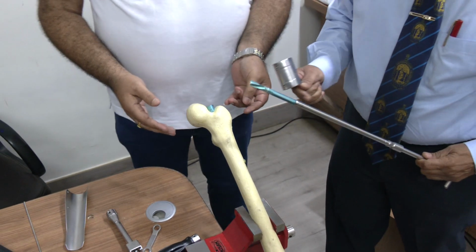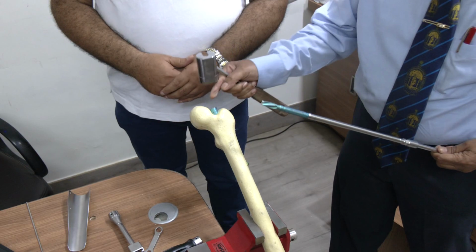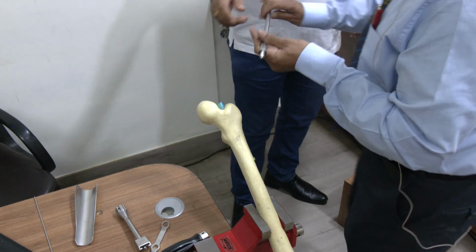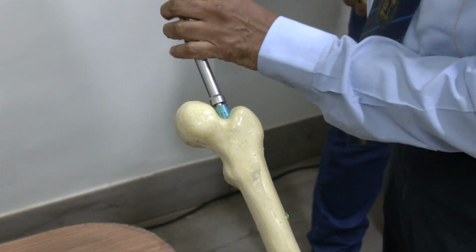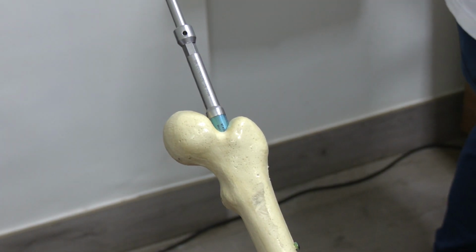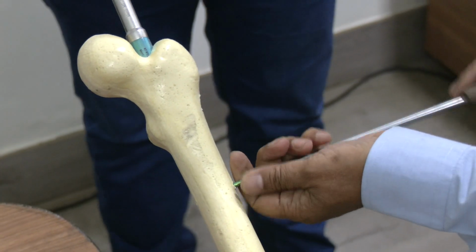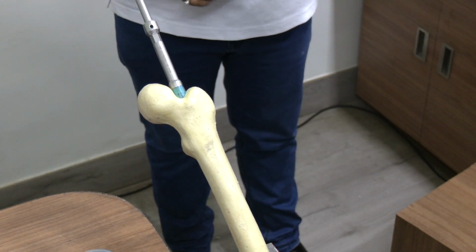Once you take out the helical blade, it is unlocked, because while passing this instrument I had already unlocked it, and now we can apply the top bolt extractor rod here, and there is a separate extractor rod which comes with this set. You apply the extractor rod and take out the distal locking. You have to take out the distal locking and extract the bolt. So I am showing the extraction also because sometimes we will not know which instrument is to be used where. So that is the usefulness of this instrument.